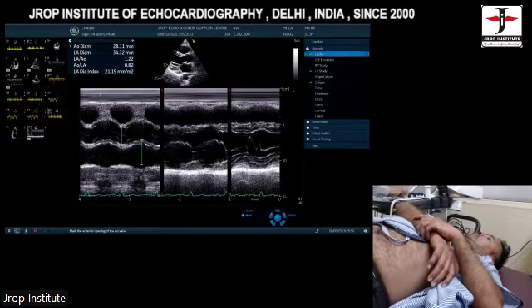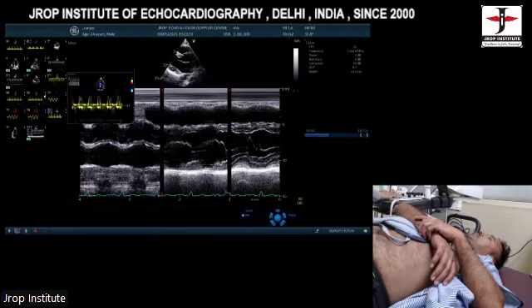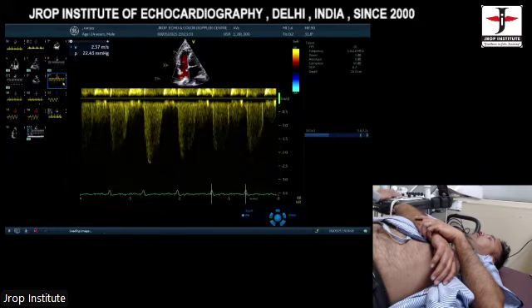So this is pulmonary artery pressure measurement. We go to the focused RV-RA view in the 4-chamber view. Look at the TR jet. Put your pulsed wave Doppler spectrum in the TR jet, or in the neck of the tricuspid regurgitation jet. Then switch on continuous wave Doppler. You get a Doppler spectrum pattern like this.